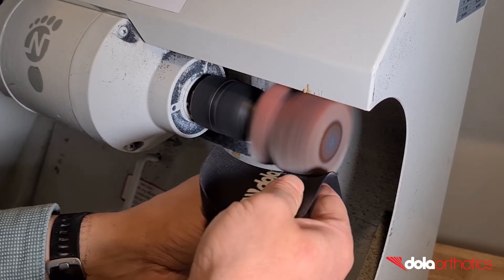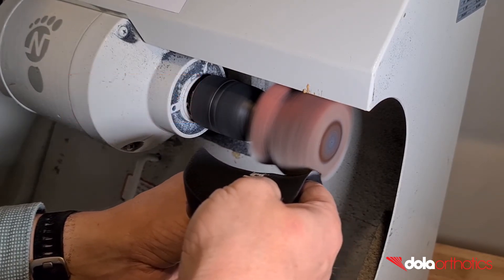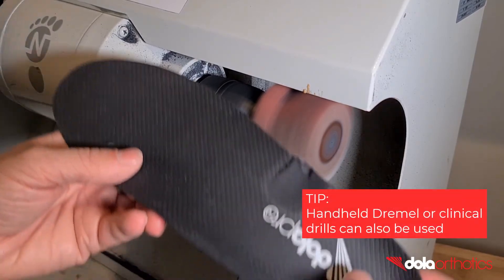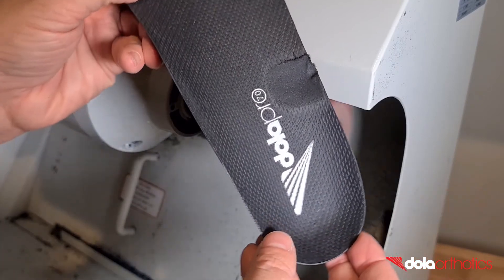A mild grind will create a small divot. A more aggressive grind will create a deeper divot. The grind can be smoothed with sandpaper or a dremel. Alternatively, a divot can be made with a handheld dremel grinder or even a burr attachment on a clinical drill.